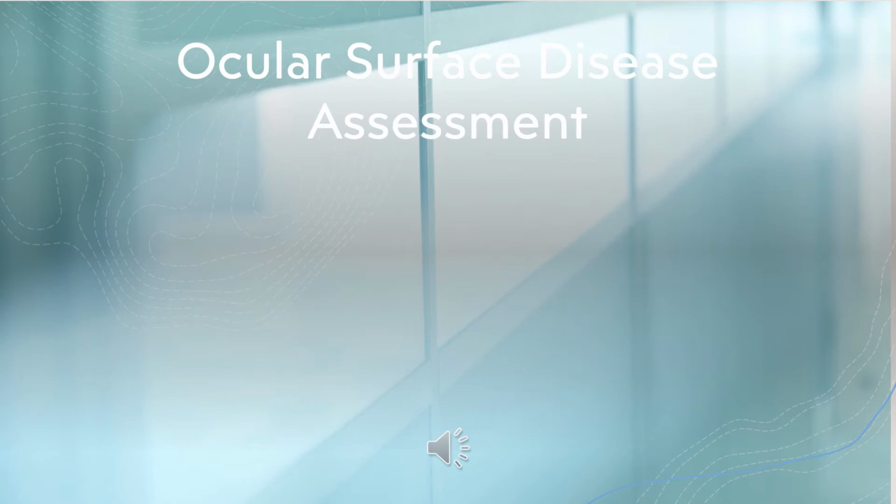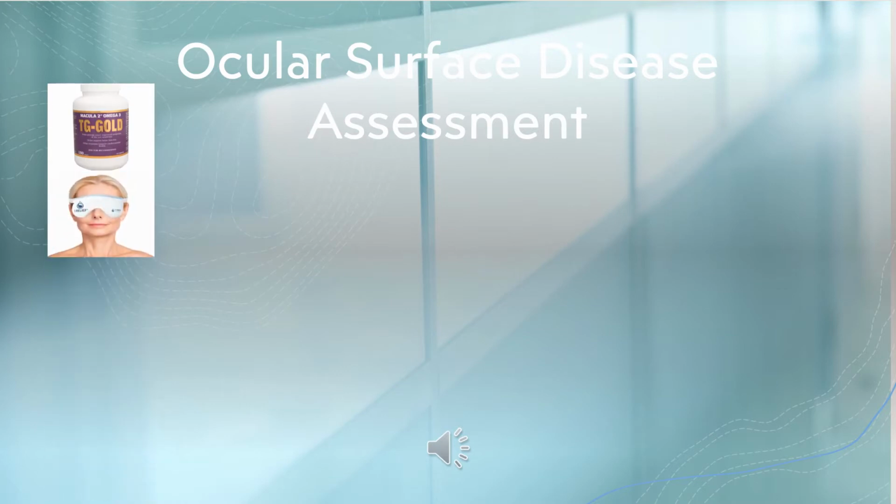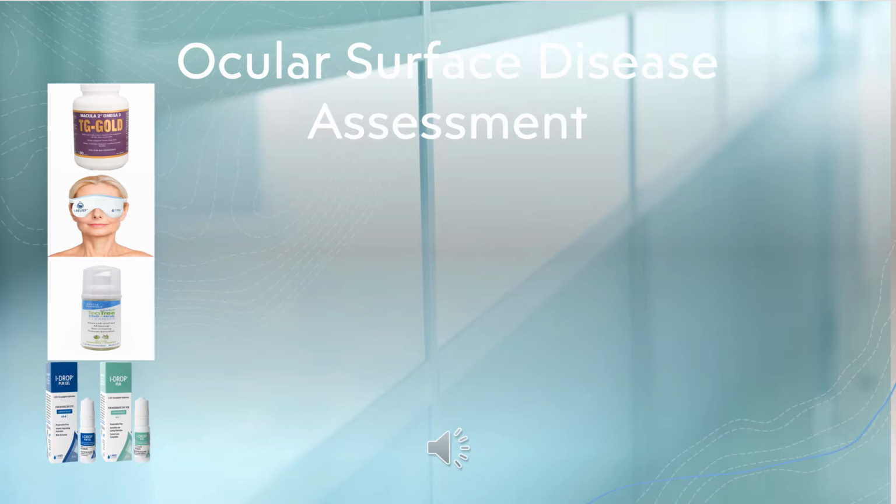Why have an ocular surface disease assessment? If you have done the basic treatment, that is omega-3s, hot compresses, lid cleaning, and ocular lubrication, and are still having symptoms, the next step is to do a more in-depth check and have some scientific numbers to help us determine the best mode of treatment.